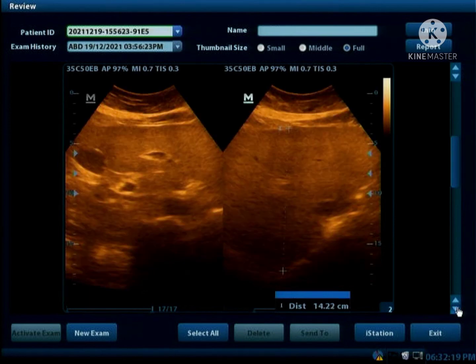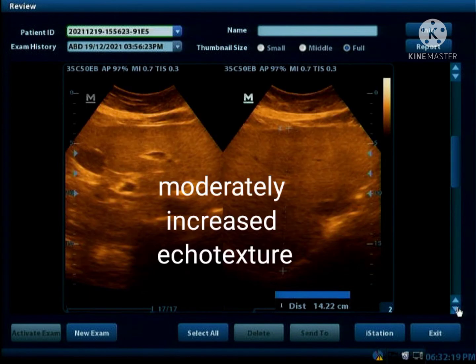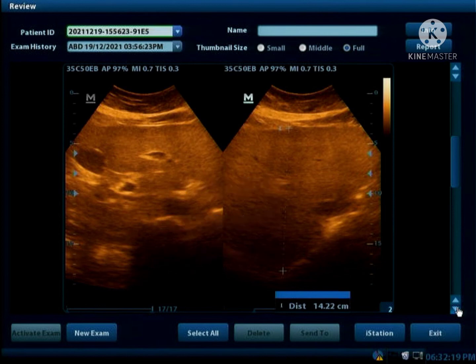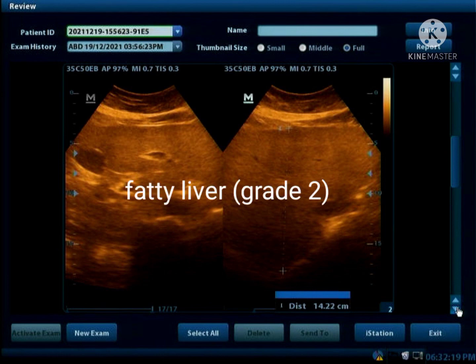Here we can see that liver parenchyma echogenicity is moderately increased, the lower border of the liver can hardly be seen, and the liver vessels are not well visualized, so this is a Grade 2 fatty liver.